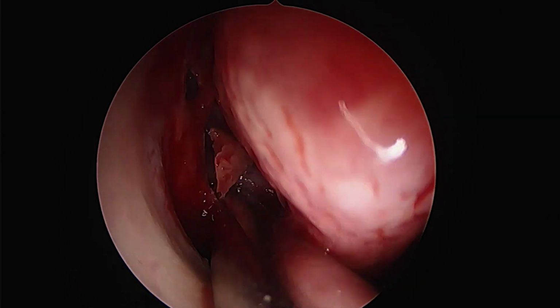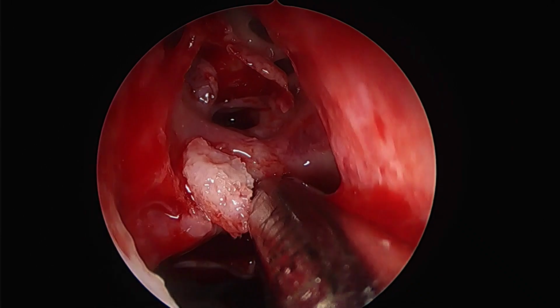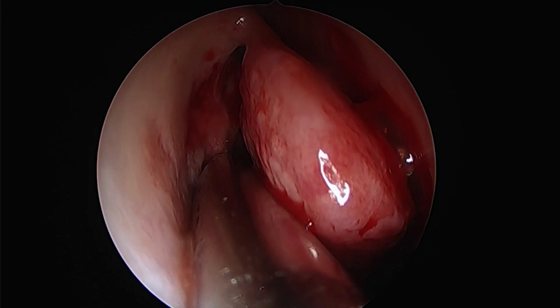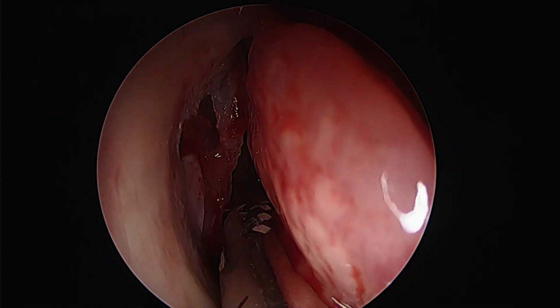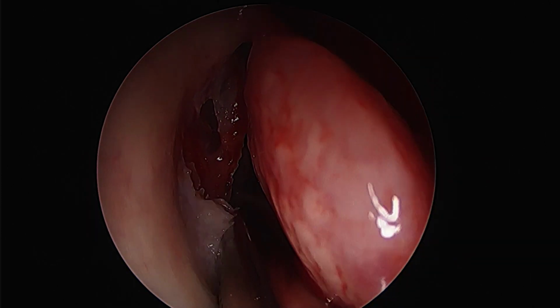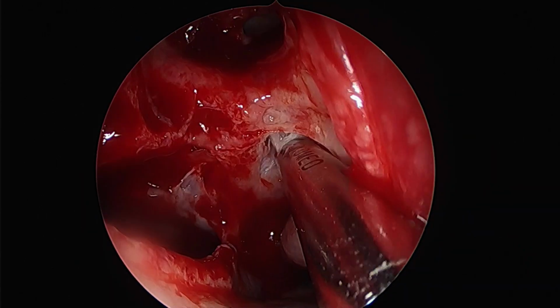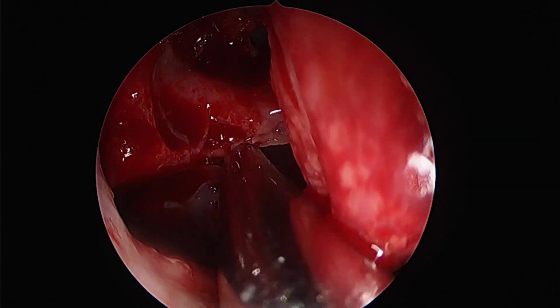At all points of time, one must try to keep a clean surgical field. It matters a lot in improving the outcomes, the performance, and keeping your surgical times limited. The more the scope goes out and in, and the more the scope gets soiled, the more time you spend on hemostasis in the end, which always affects your surgical times. And obviously we do not want any hemostasis troubles towards the end of surgery, the most important part, when we actually conduct the repair.